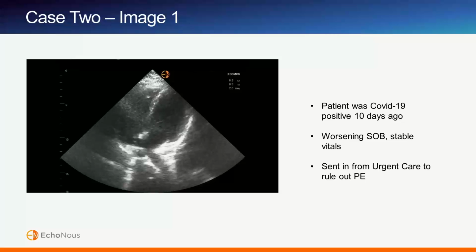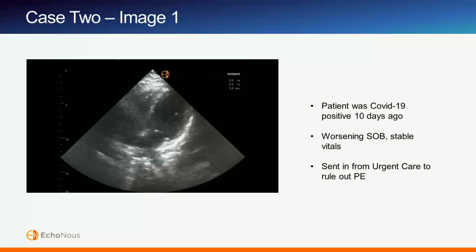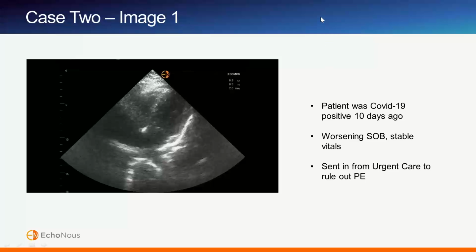Right. So, some things about this image that I'm looking at, we're a little bit off axis, which will affect how we compare the chamber size. And that probably is making us not able to see that free wall a bit. So you can always rotate your patients a bit, swing your probe out just a bit, and try to get the septum right there as vertical as you can. But looking at it though, the RV doesn't look huge, but it's really tricky. I would say it's potentially nearing 1-to-1. It does look big, like it's flaring out, but we're not seeing the entire thing.